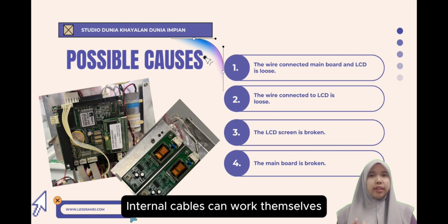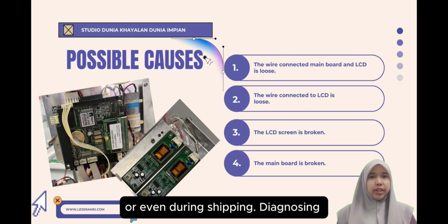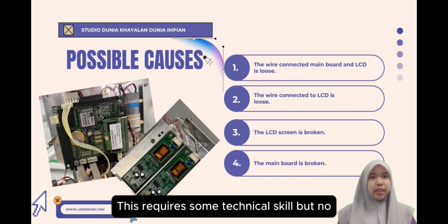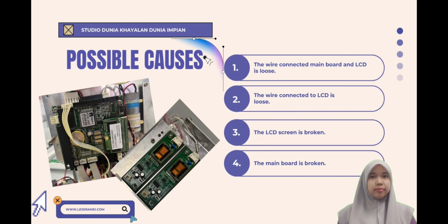Internal cables can work themselves loose due to movement, minor impacts, or even during shipping. Diagnosing this involves carefully opening the device and resetting the cable connections. This requires some technical skill but no new parts, making it our ideal first check.